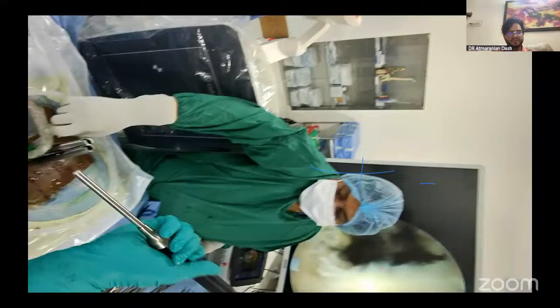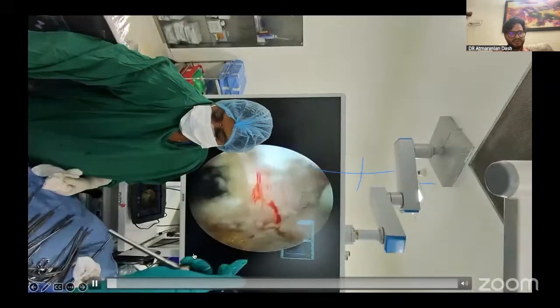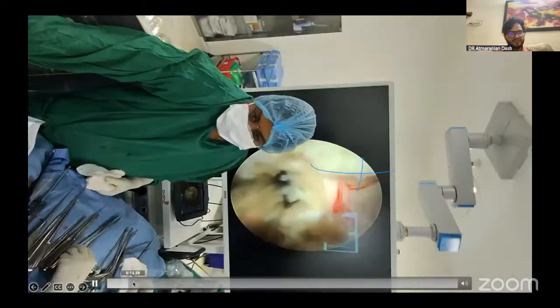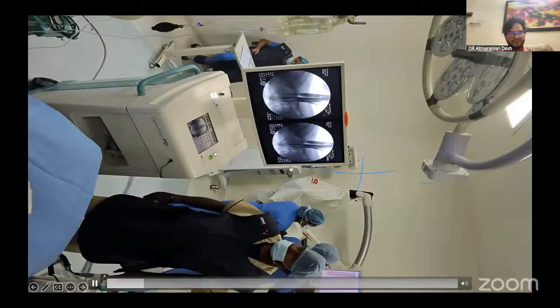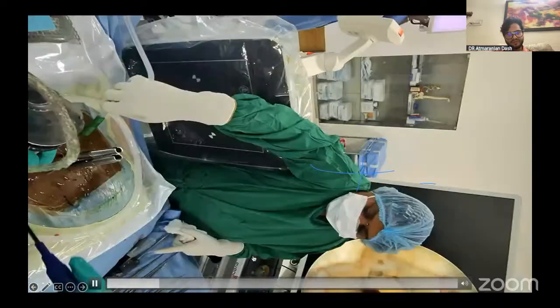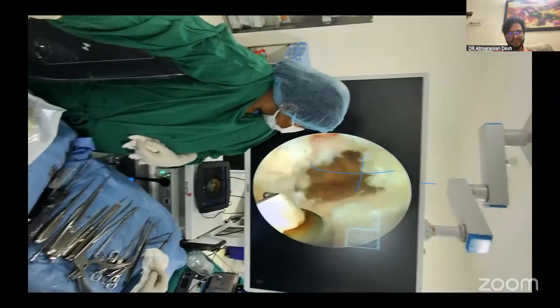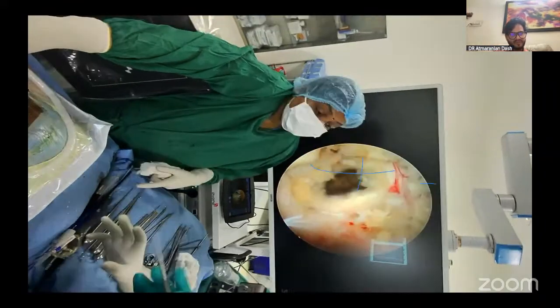You can see the bone dust going in, how we can go and put the bone dust or bone fragments there. You don't need to retract anything, just go there, and through this the cage will go. So the bone material you can see there. You can put the bone forming material anterior to the discal space where the fusion starts. So all this is bone material going there. How much space was made with biportal, and how clear biportal is: we see better, we work better, and this surgery becomes very very safe for the patient.